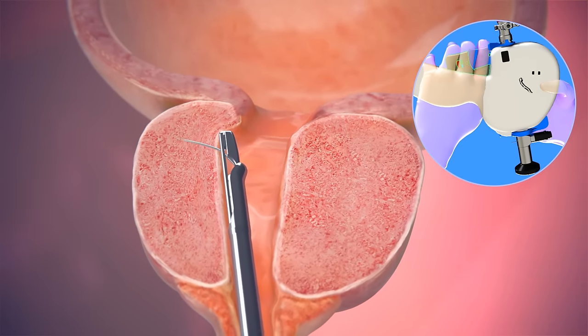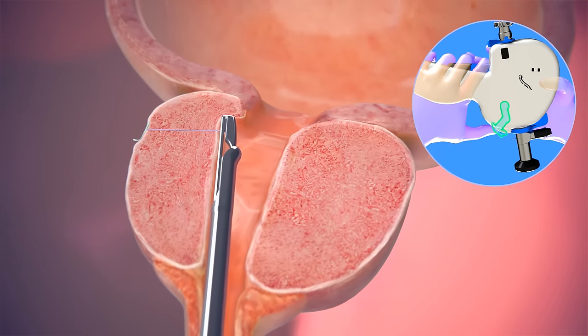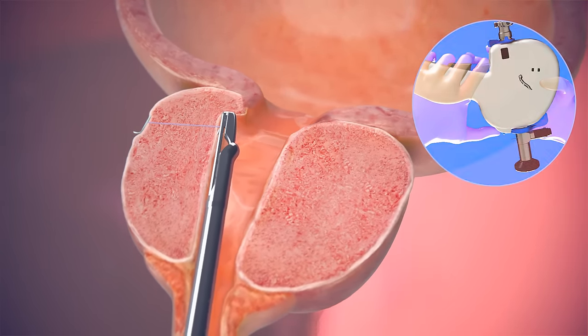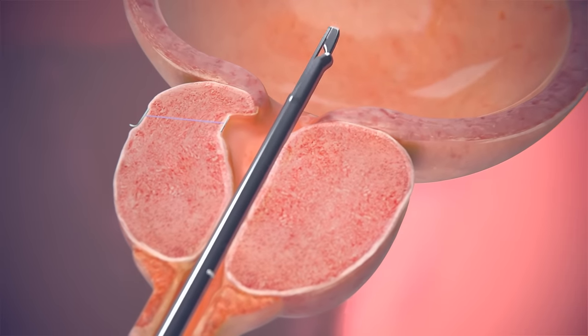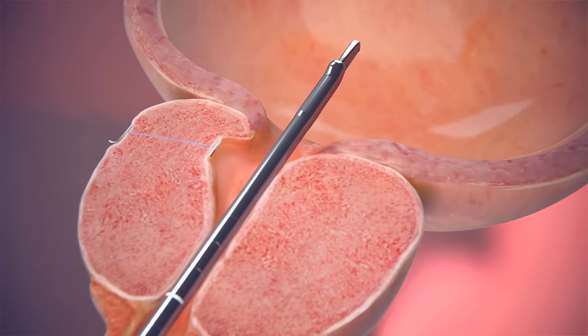Following a trigger press, the device inserts a fine 19-gauge hollow needle across the prostate and deploys the implant through the needle. The implant is a nylon suture fixed in place with a thin metal tab at each end.